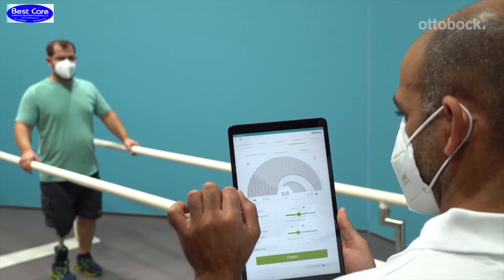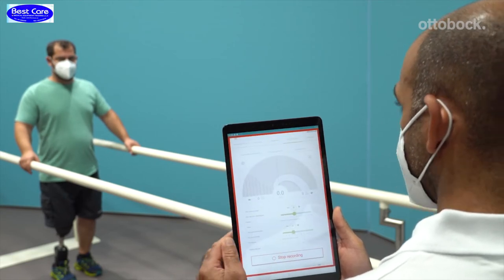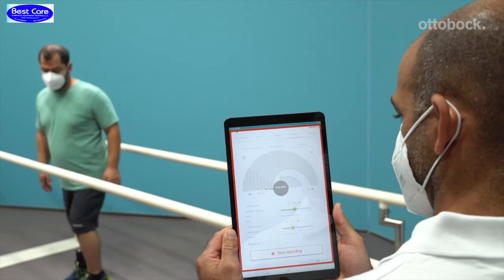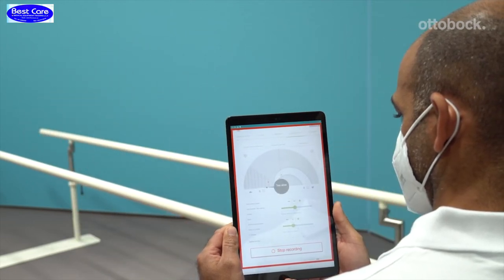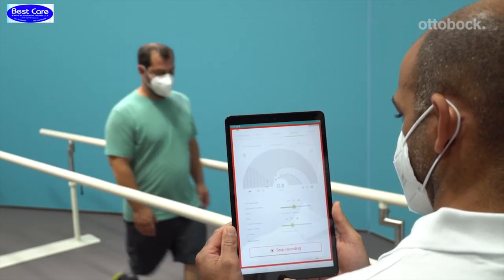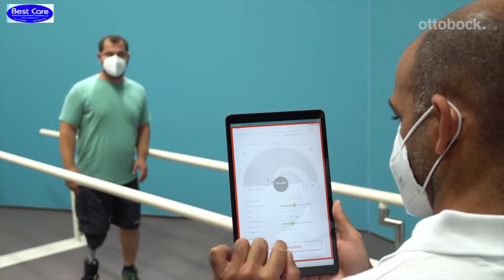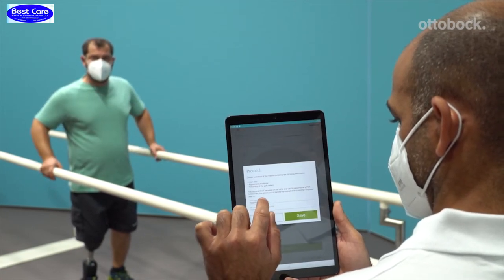The settings are optimal and you can create a tuning record by clicking the finish button, followed by the start recording button. In order to create a proper tuning record, have the user walk at a slow, medium, and fast walking speed. When complete, the patient data and settings can be saved.